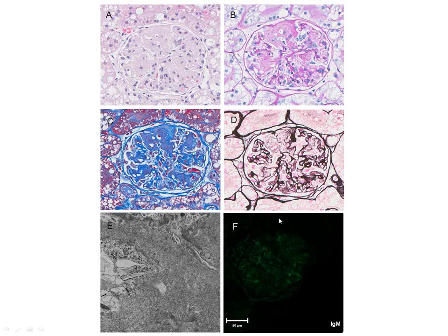Okay, and I did not give you the diagnostic stain for this panel, but what would you think that this disease is? Amyloid? Yeah, exactly. So the key for amyloid is the fact that, like I've said a couple of times, the JMS isn't going to pick it up. It's not argyrophilic, or however the word is. So the JMS doesn't pick it up.